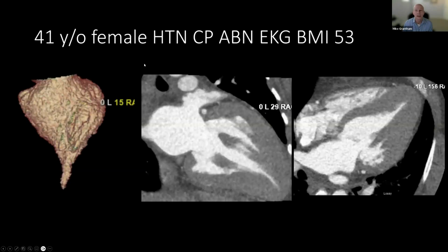So another challenging type of patient is your large BMI patients. And there are some tricks you can do to keep your image quality up. Our BMI cutoff with our old tube was 40. We only raised it 5 with our new tube. Our BMI cutoff is 45 now. But our image quality certainly did improve on those patients with the new tube.